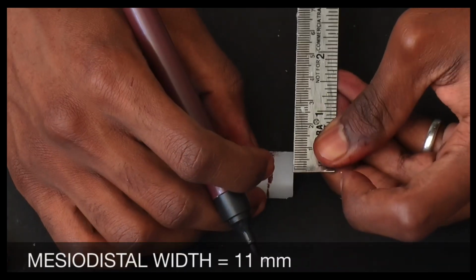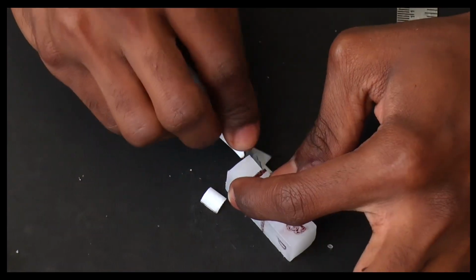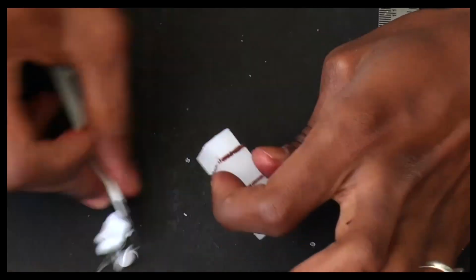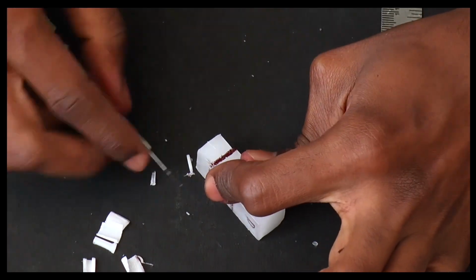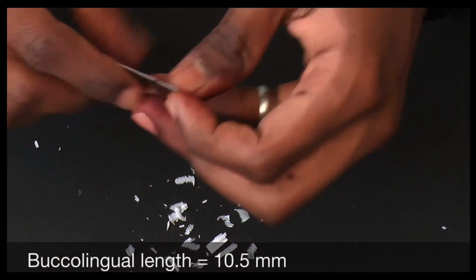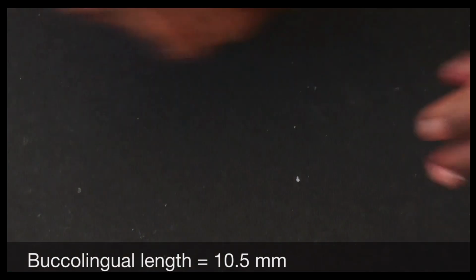The mesiodistal width is 11 mm, and the buccolingual length is 10.5 mm.